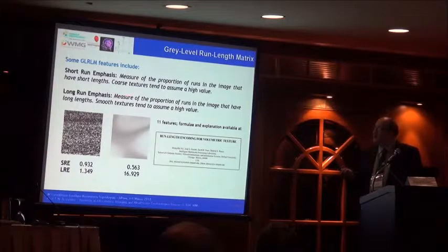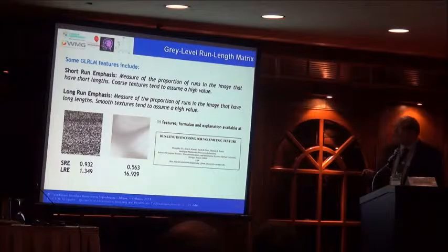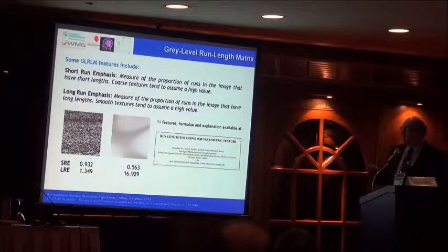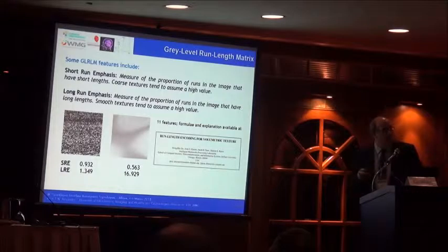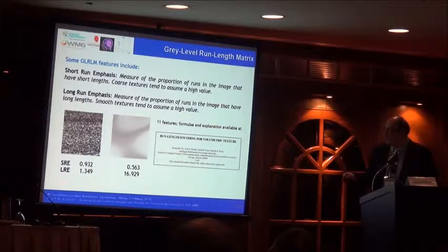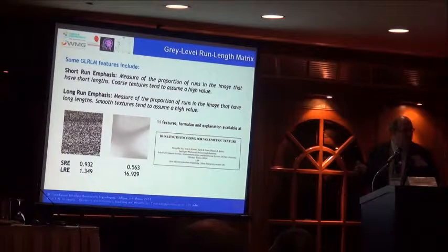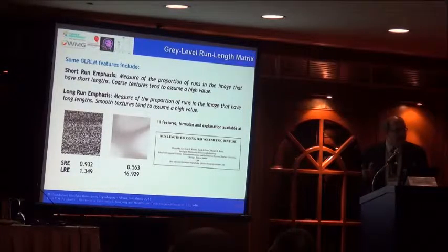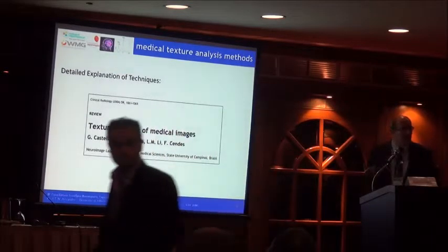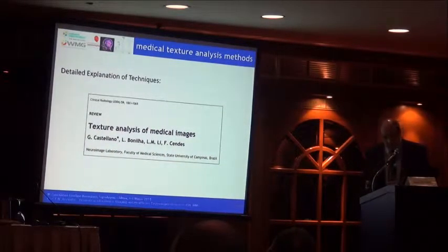information of the tumor. So now we have solved the gross morphology, we can look at those textures, and of course this might tell us something about changes in heterogeneity, while long-run emphasis can tell us about smooth textures, which is very important when we look at the diffusion of tumors into the brain. While the first one can tell us about distinct tumors that are well delineated in the brain.